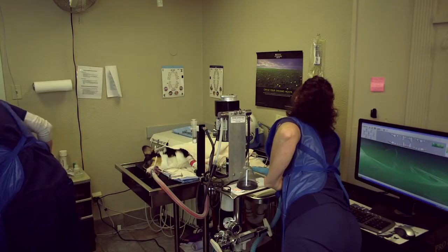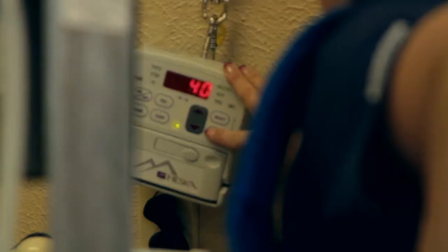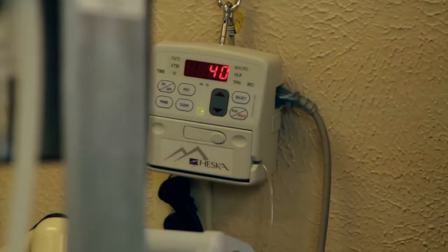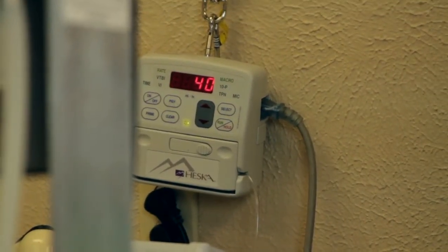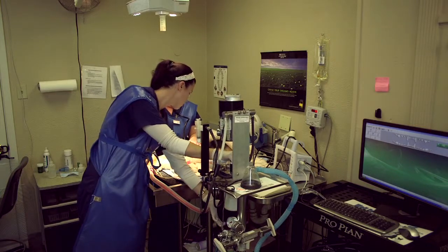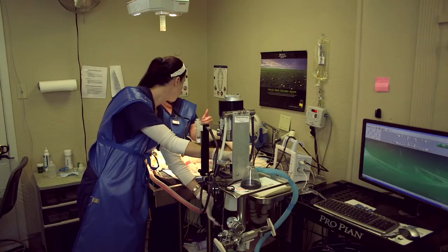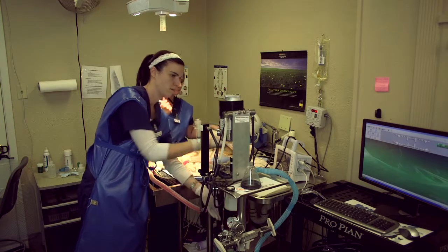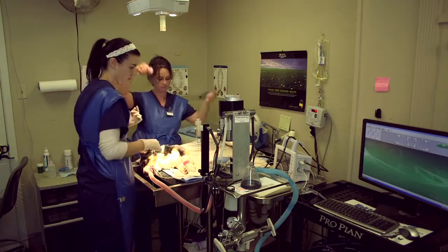The box hanging on the wall there is an IV fluid pump. It is pumping fluids into SNAP's body at the rate of 40 milliliters per hour. Now what we're going to do is Miss Dallas is going to listen for breath sounds on both sides of SNAP's chest to make sure the tube is placed properly. Miss Chiquita gives a breath and Dallas listens.